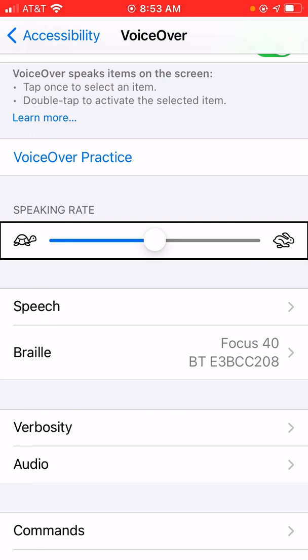Hello everyone. This is Stephen Daugherty here with another Austin Lighthouse Tech Tip. Today, I'm going to briefly go over how you can customize VoiceOver gestures on iOS for individual Braille devices.